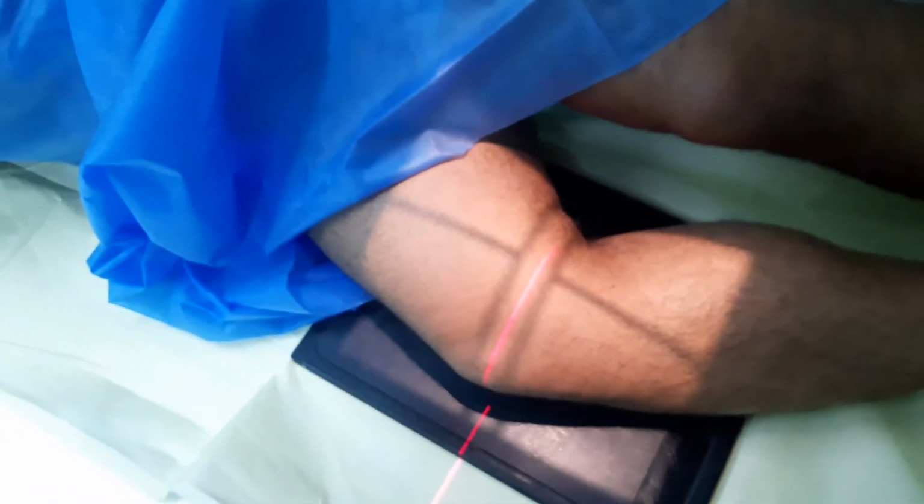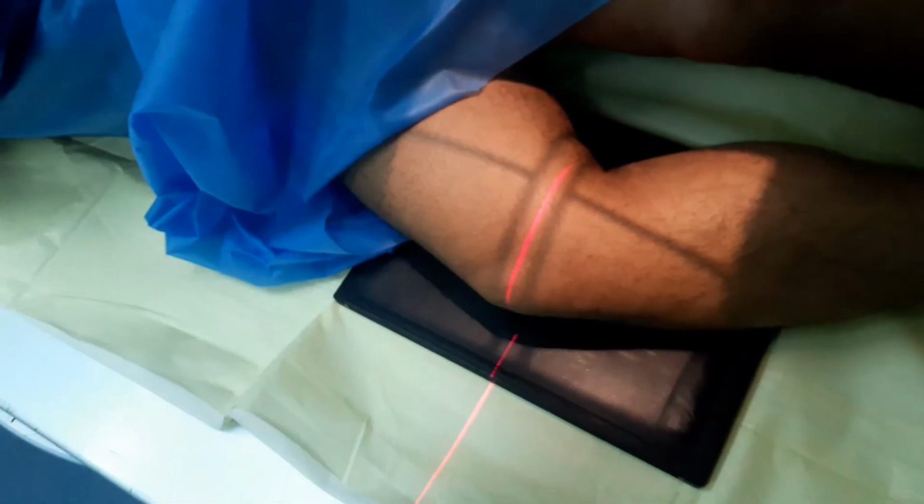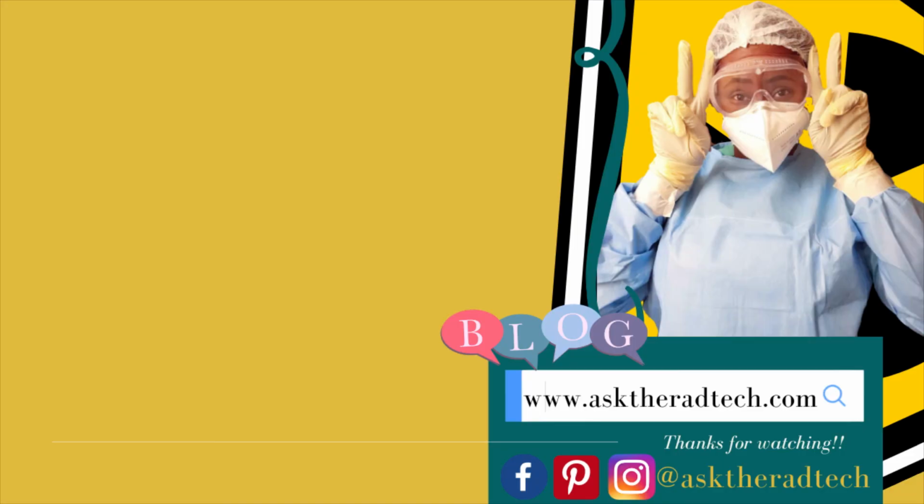Palpate for the condyle again, and it's a half inch distal to that. But you could also eye it too, and you know that this is the midpoint of what you're looking at, right? Where the knee joints will line up. You collimate to suit, and you ensure that you get everything showing, that you don't clip off the patella or anything like that. And you open up again to include everything that you need. And that is the lateral knee.